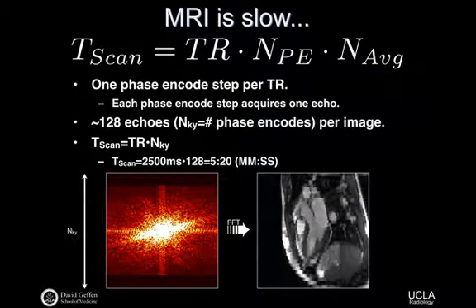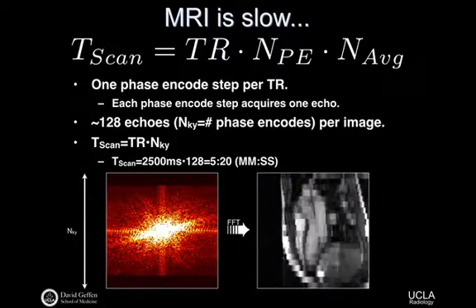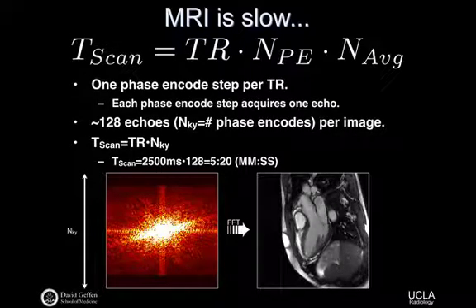And in fact, we could repeat that whole process. We could get all the k-space twice, or three times, or 10 times. And we call that averaging. The reason to do that is if you have low image quality, it may be useful to acquire the image four times and average it to push the noise variance down and get the signal to have a better appearance in the presence of the noise.